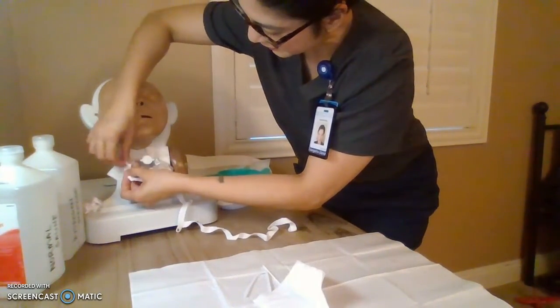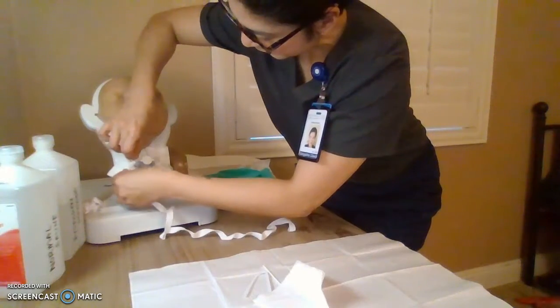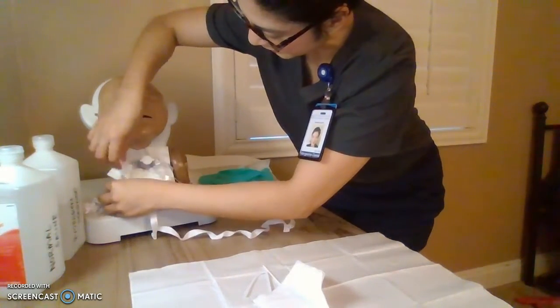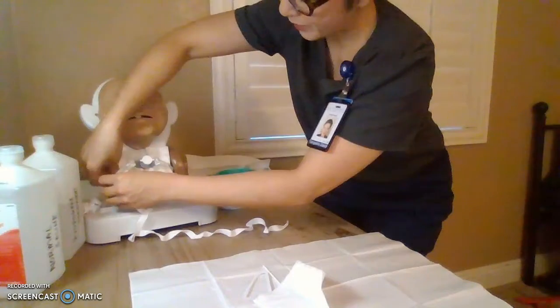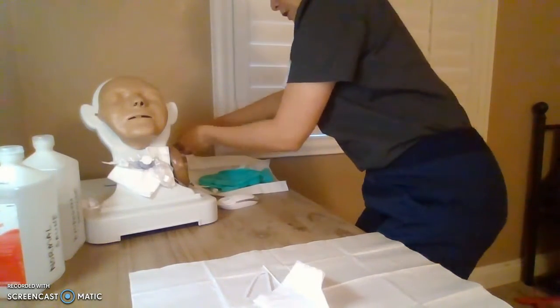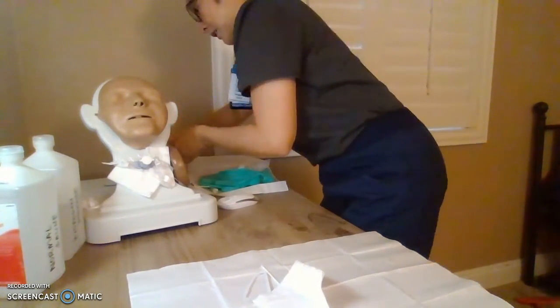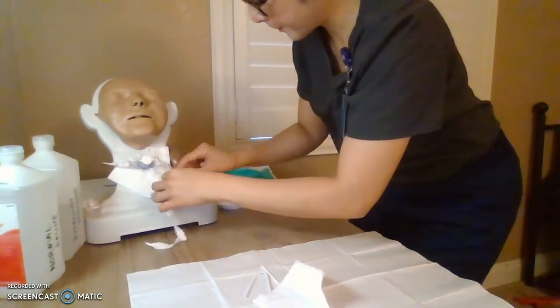This is the one tie step. Okay. Now that's done. Make sure the knot is away from your patient's skin. Okay, away. So now we're going to go around. Around. Make sure it's not twisted, not too tight.